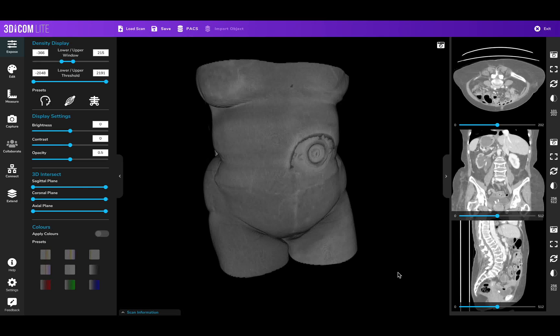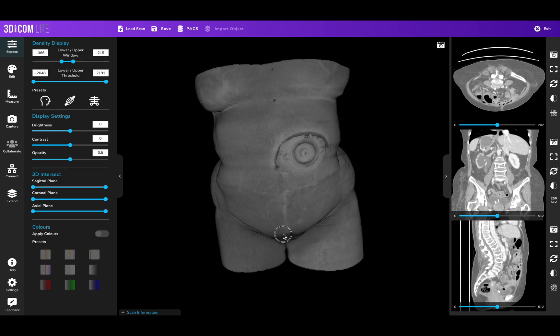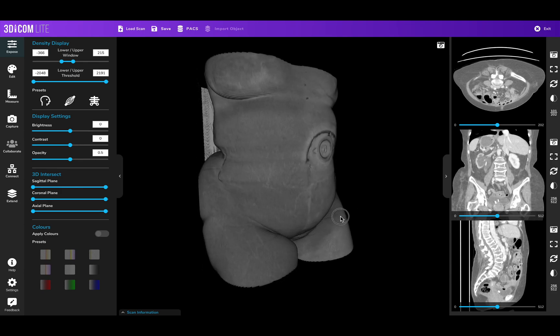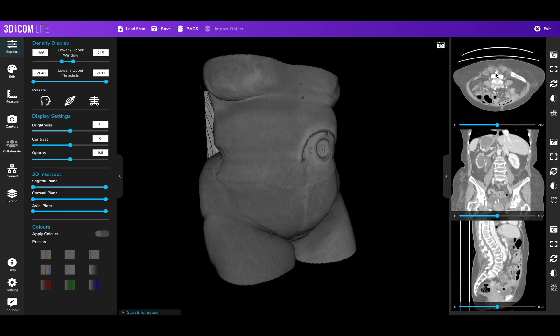Hello and welcome to another 3DICOM video. In this video we're looking at how to capture screenshots using 3DICOM Light, so that you can better communicate your 3D volumetric model of the patient-specific anatomy and also the raw slices from the DICOM data.